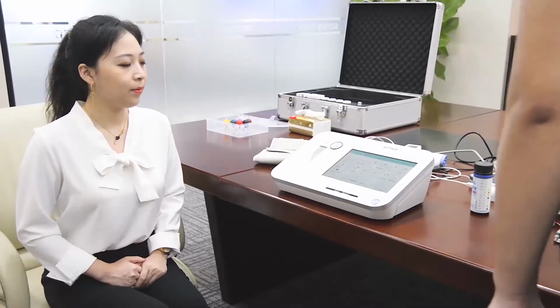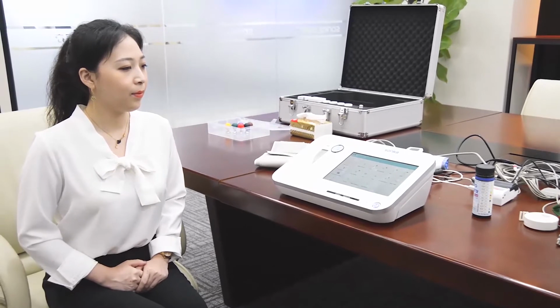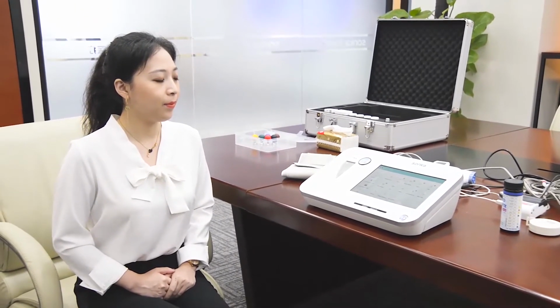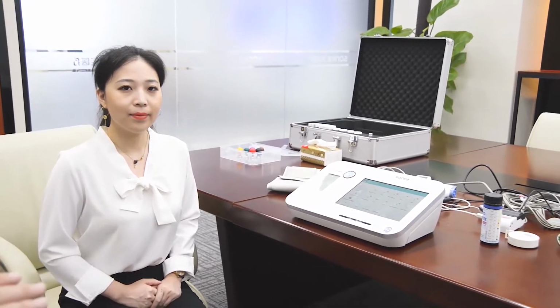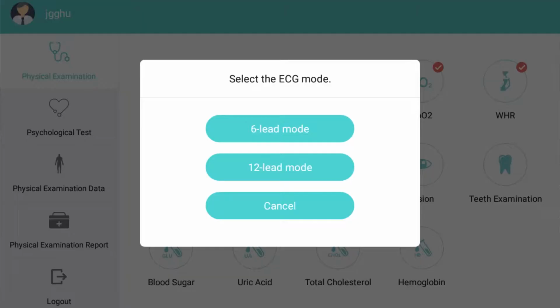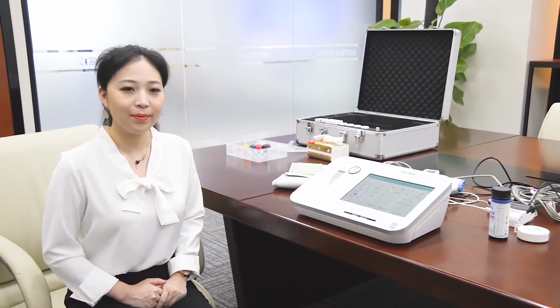Now we go to the next step, and this one is electrocardiogram, ECG. We have two options. One is 12 leads, where the patient needs to lie down on the bed, but for the demonstration we use the simple one, 6 leads. We put the clip on the wrist and ankle. Okay, please.